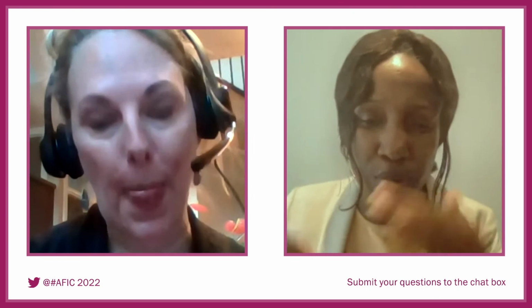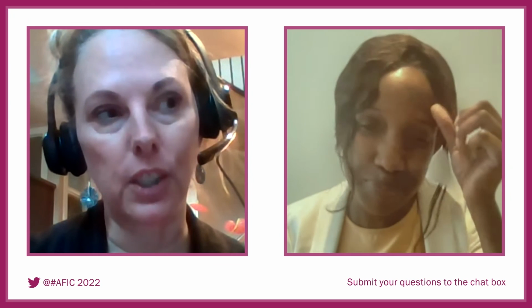And I don't know, Steph, what you think, but I think later on in gestation, sometimes right and left helps. Yeah. It's hard when they're on top of each other, that's sometimes confusing, but knowing who's right and left often helps. Earlier in gestation, they might switch, but later on they tend to stay, I think, most of the time, right? Yeah, for sure, depending on amniotic fluid and multiparity. I do use ultrasound in my office a lot for twins. I don't even do just heartbeats alone because I do look at position. And it's interesting, moms actually will be able to identify which baby is which themselves from fetal movement.